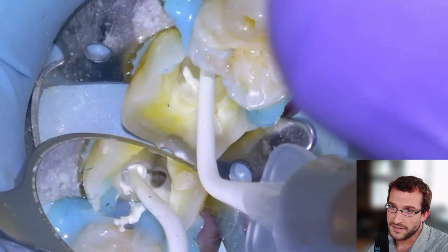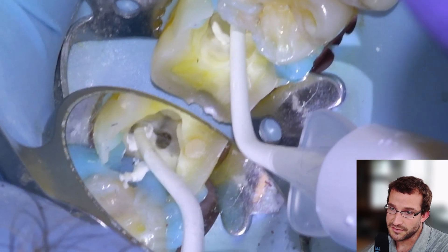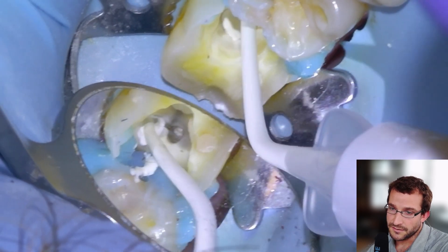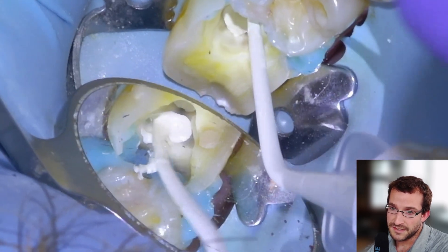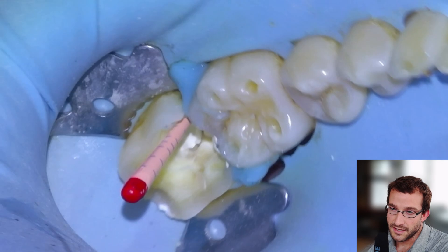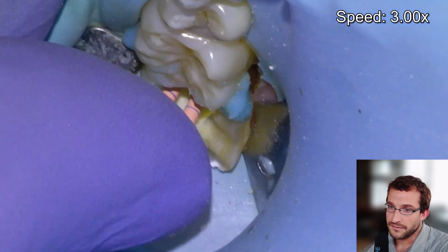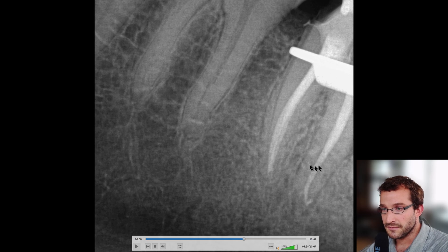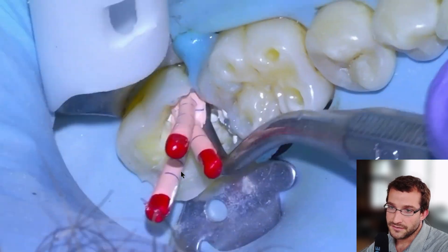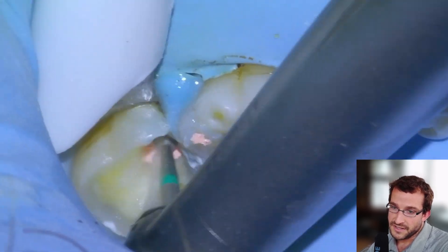We'll put sealer into the mesio-buccal and mesio-lingual canals, and we'll see it come out the mesio-buccal — so that's going to be well filled up. Then we'll put our GP cones in and call it a day for the endo. Fast forward here — three cones, and there's the x-ray that we take once the cones are in. We're satisfied with that.